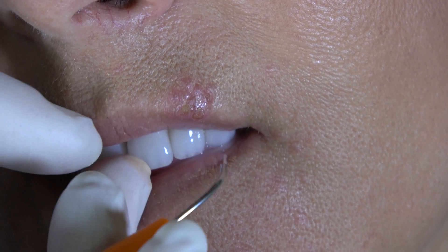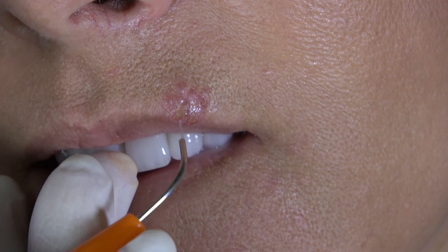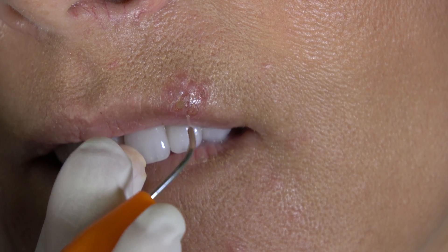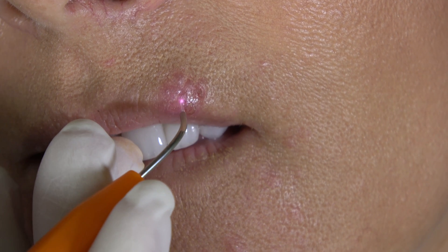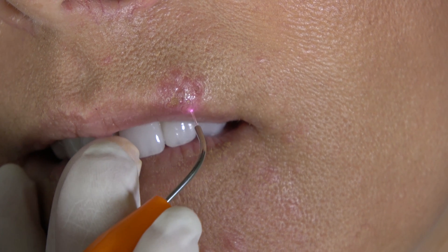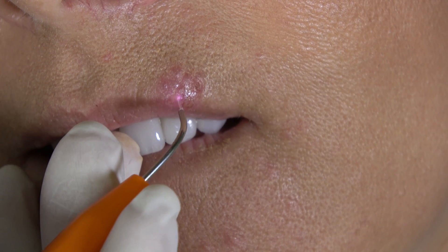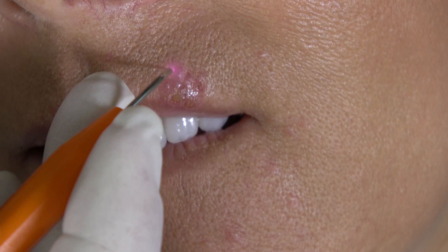Anywhere where I actually have open lesion, you'll see the pinkish, whitish color of the lesion become almost a straw color, slightly brown. So I'm actually able now to touch the lesion where I couldn't initially.